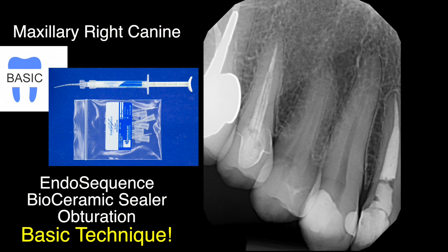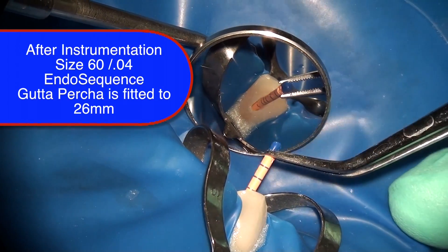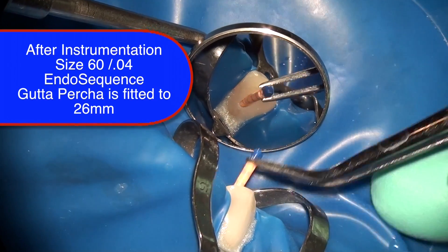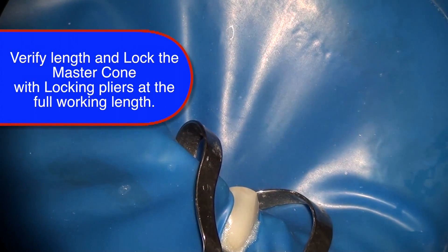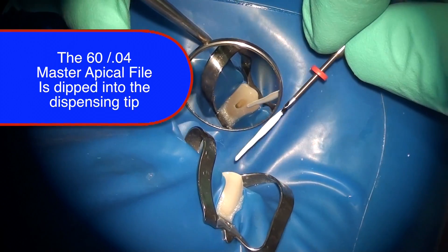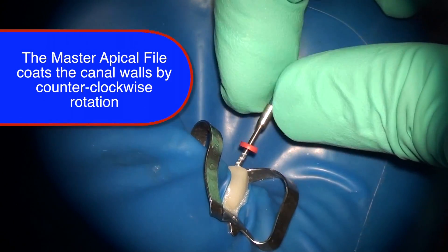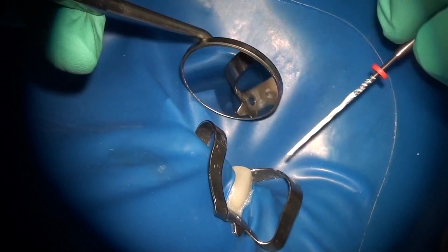Now let's take a look at the basic obturation technique in a very easy, straightforward canine tooth — the kind of case that everyone watching this video and doing endo is likely going to encounter. This is a maxillary right canine tooth. Following instrumentation with the EndoSequence instrumentation system to size 60, the EndoSequence gutta percha cone is fitted to 26 millimeters, which is the working length. After drying the canal, bioceramic sealer is dispensed into the dispensing tip and the master apical file is dipped into it. After full coating, it is inserted into the canal to full working length and rotated in a counter-clockwise direction, facilitating canal coating in a clean and predictable manner.